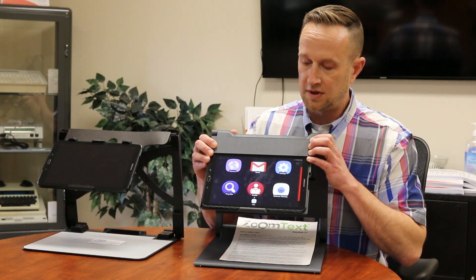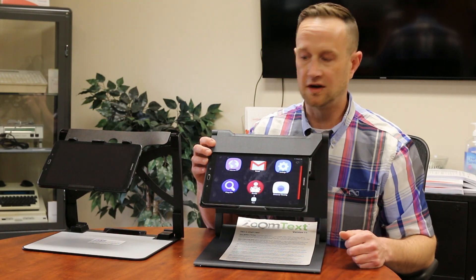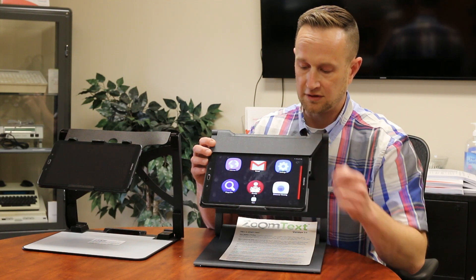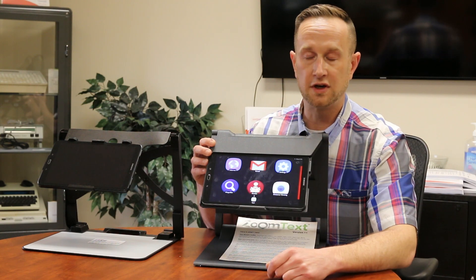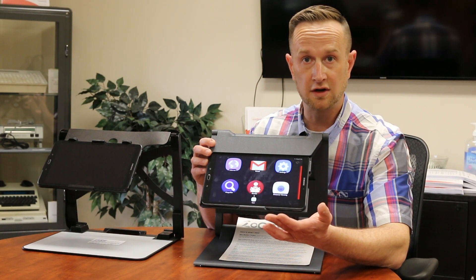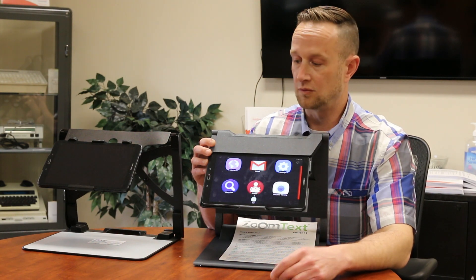As you can see here, the device itself, once turned on, has six major icons. The top three all have to do with getting on the internet — you've got the internet, Gmail, and your settings as well. The bottom three all have to do with the video magnifier: you have the magnifier itself, you have a reader for OCR optical character recognition, and then you have the distance viewing.